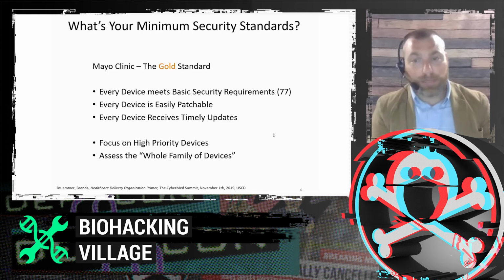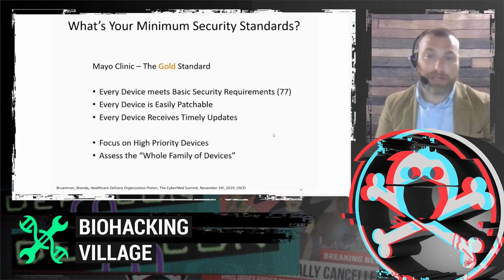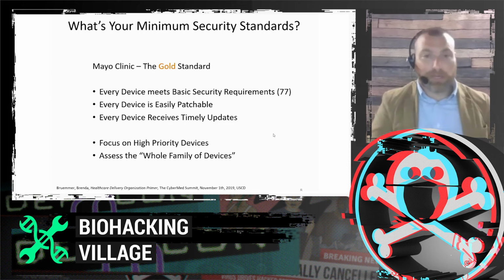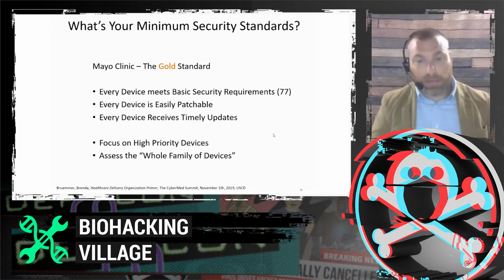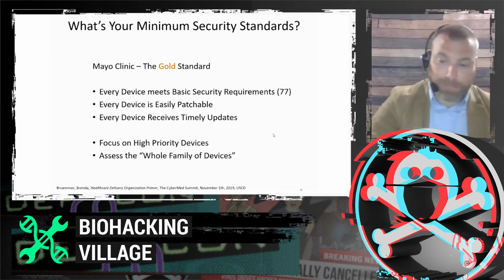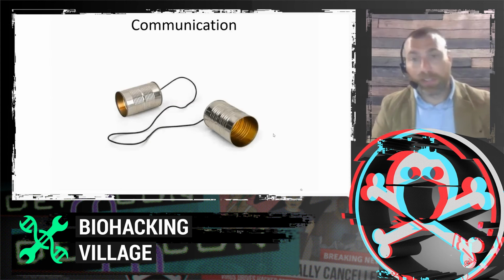If you're purchasing, say, 5 different point of care devices that are all different, and the risk may be low for each of those devices, but all of those devices send unencrypted traffic to a middleware application, you want to look at that whole family of devices and not miss something, understanding that the sum of all the parts differs from just looking at the devices individually.